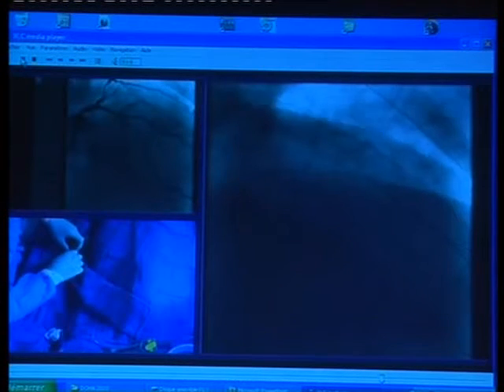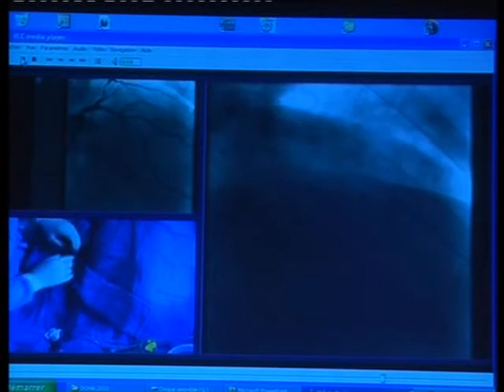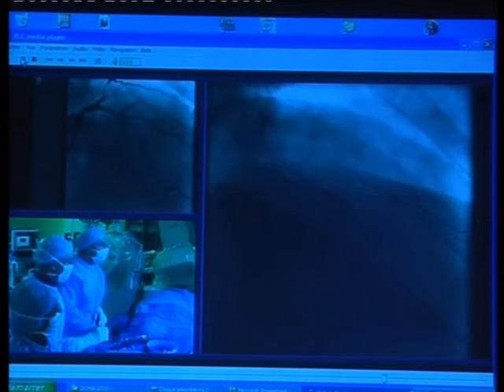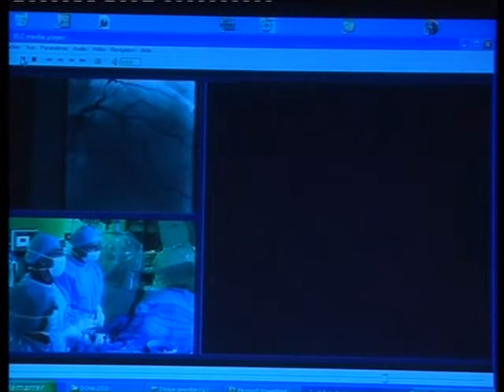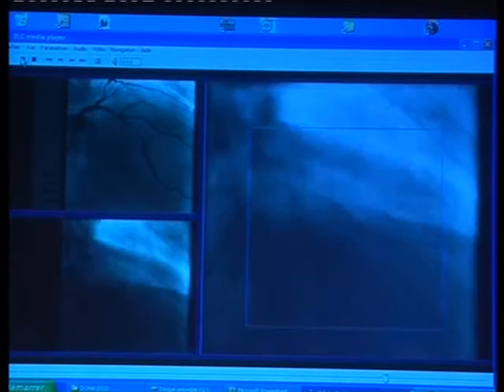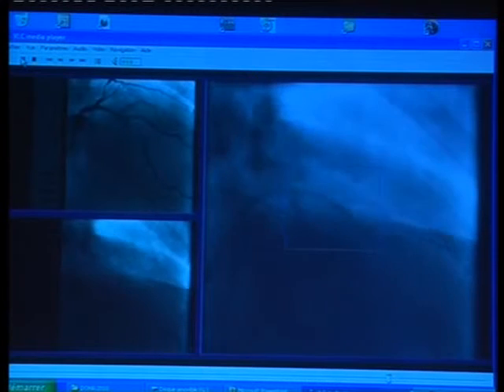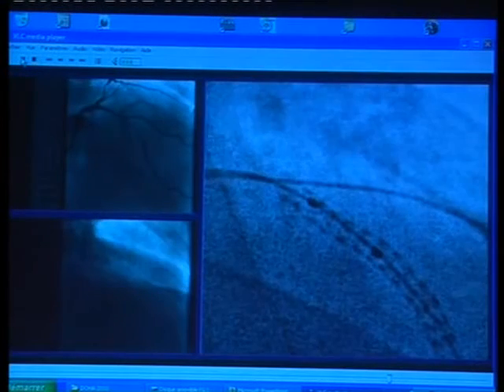It's the problem of the treatment of the edge, residual stenosis. The nice thing with this is that we can see it without having to put any contrast in. You can see quite clearly that we're nicely in the stent. Or you can do the stent boost again. I think it seems to be correct. There is maybe 1 millimeter above. We are inside the stent, and often the balloon inflates a little bit above the marker, so I think it will be okay. Yeah, that nicely demonstrates that.